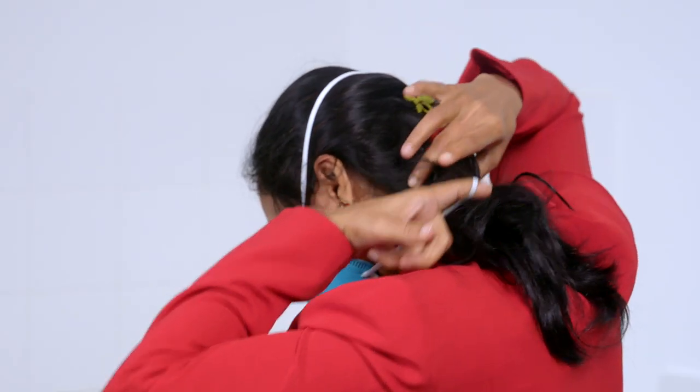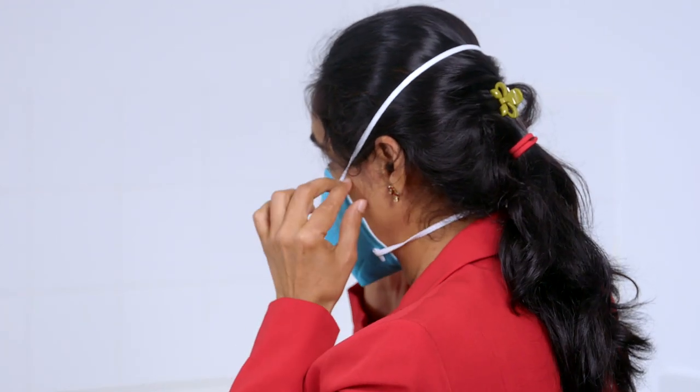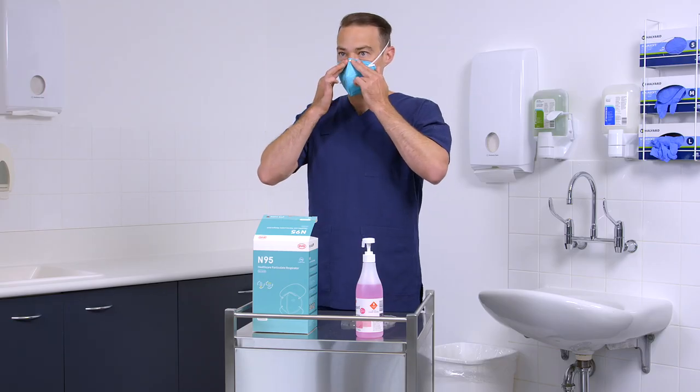Make sure that hair, facial hair, jewellery and clothing are not between your face and the respirator as they will interfere with the fit. Compress the respirator to ensure a seal across the face, cheeks and the bridge of nose. Continue to adjust the respirator and secure the edges until you feel you have achieved a close fit. Once fitted, perform the fit check.